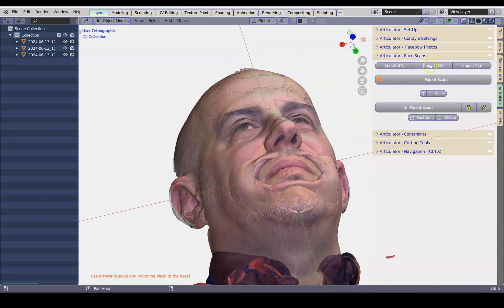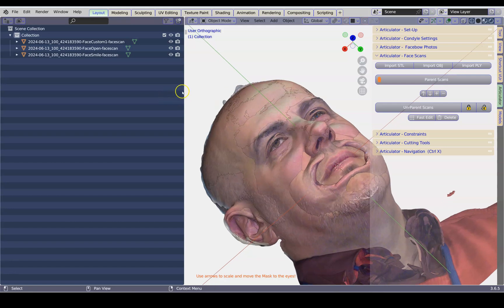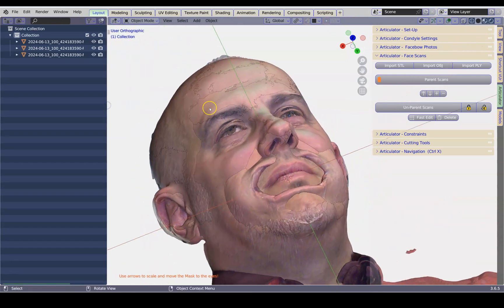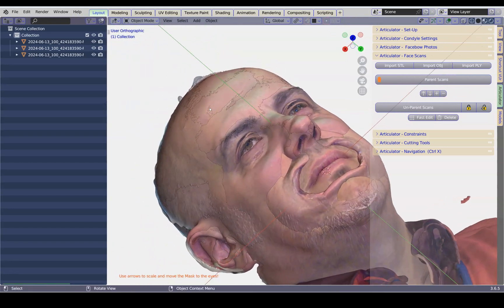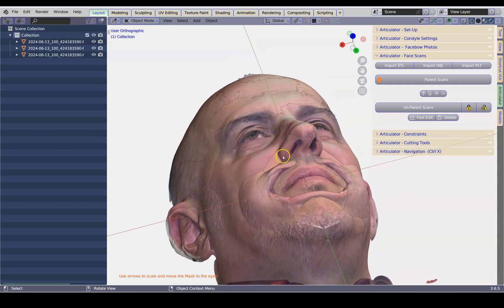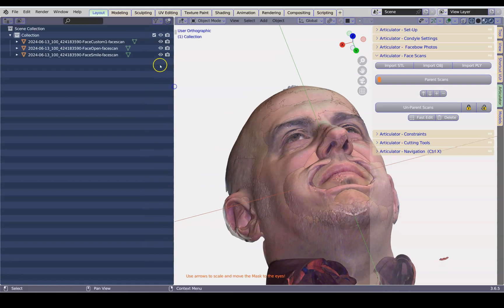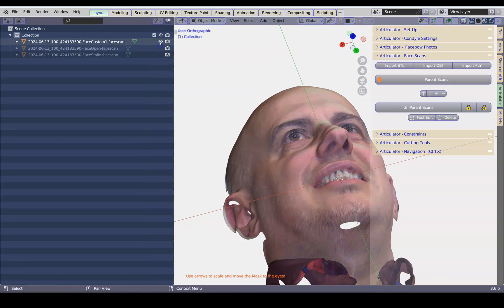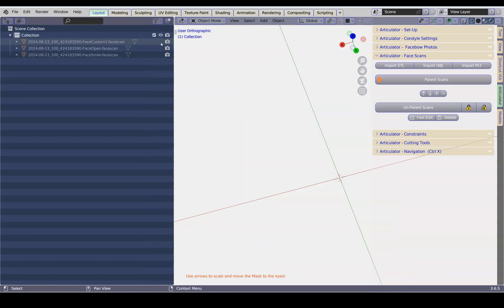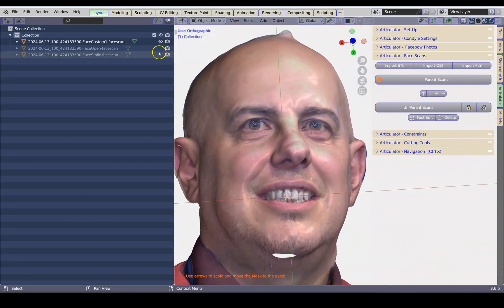We've got import STL, OBJ, or PLY. Sometimes you have more than one face scan, which means that we'd like to parent them. Depending on the software, some software align it automatically. This one, for example, we've got three different ones.